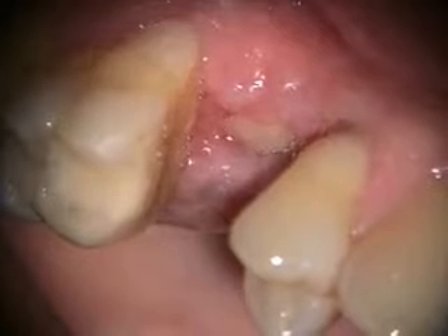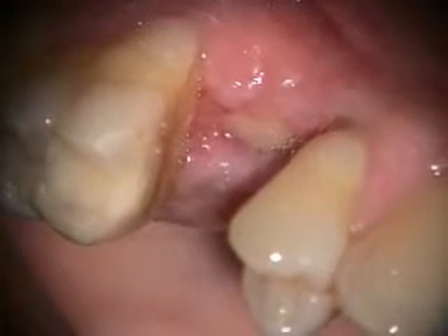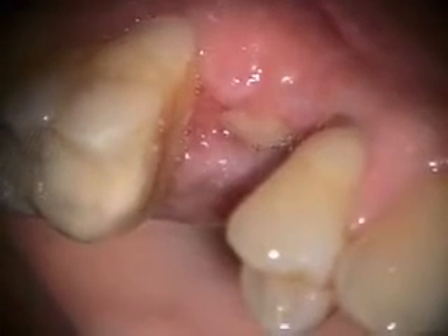This is the two-week healing of the implant removal and bone graft in the number four site, and we'll take a look at the x-ray next.